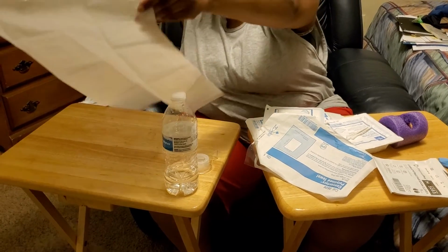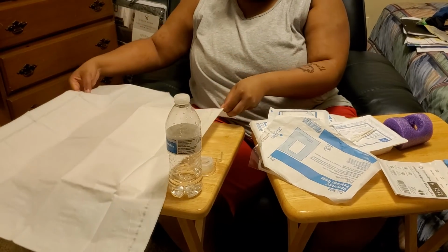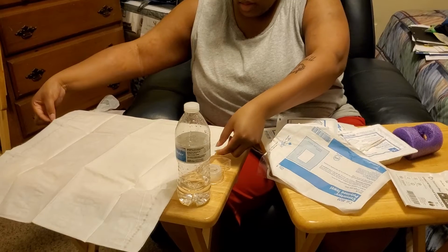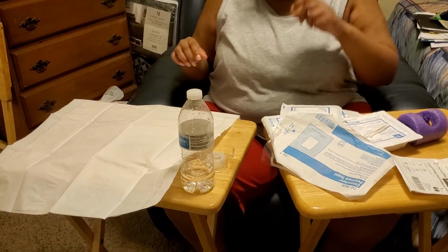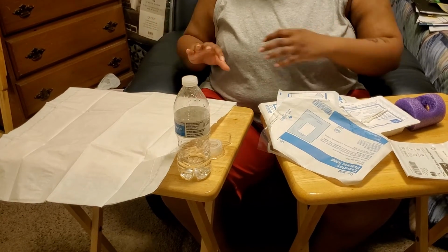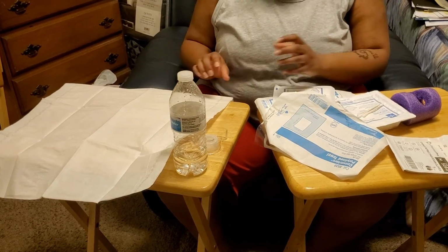And I will place it onto the table. Alright, so now what this does is it provides me a sterile area for my sterile materials.